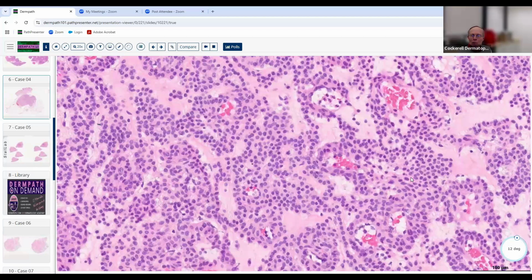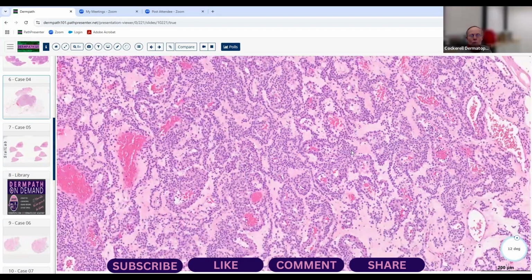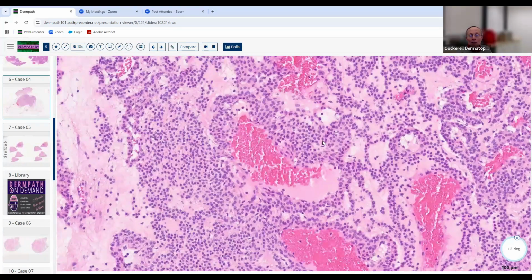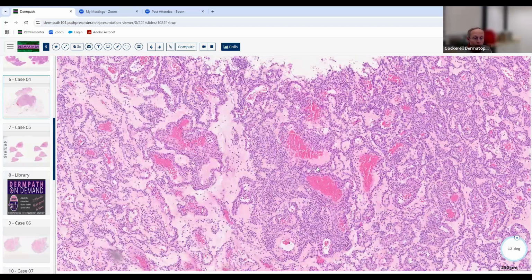There's not too terribly many diseases that you need to know about where the cells really look like little cookie cutter clones. But those are probably three of the most common. And when you see that, think about those various entities and then start looking for other criteria to help you make the diagnosis. Here, obviously, you've got the blood vessel, so you wouldn't confuse this with either a mast cell tumor or an adnexal tumor. Now, sometimes if you see the solitary glomus tumor, that can look very like an adnexal tumor, like a hidradenoma sometimes. So in a case that's not clear, you can always do immunoperoxidase stains.